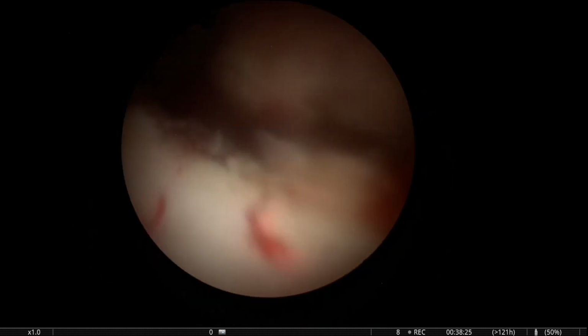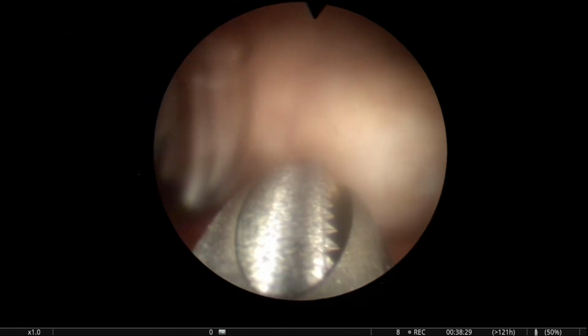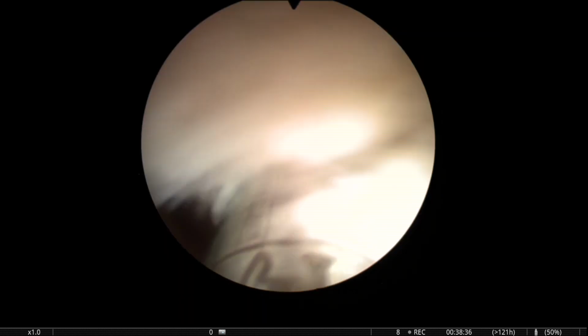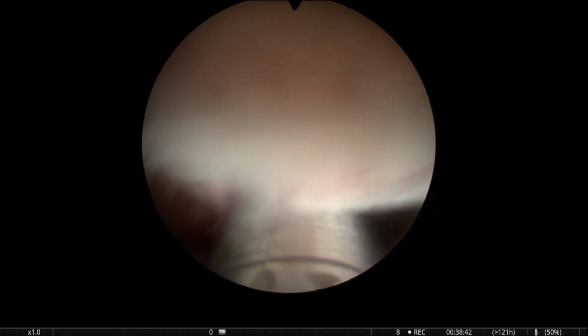You see that I was not able to coagulate the mucosa there perfectly, but here now I have the morcellator in a safe position, 2 or 3 centimeters above the bladder neck, and see how I keep the blade a little bit inside so that I can see 2 black triangles on the sides of the blade that tell me that I'm far away from the mucosa.